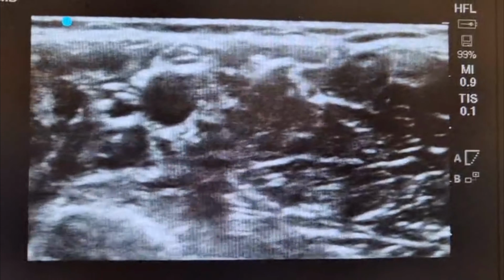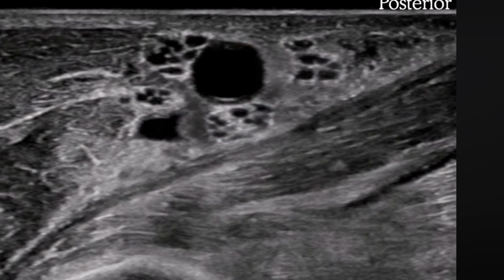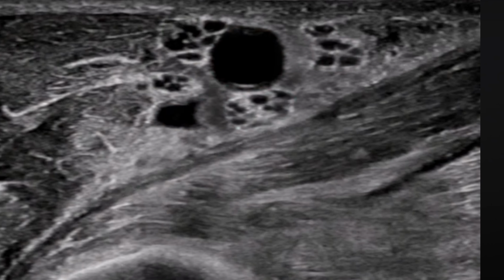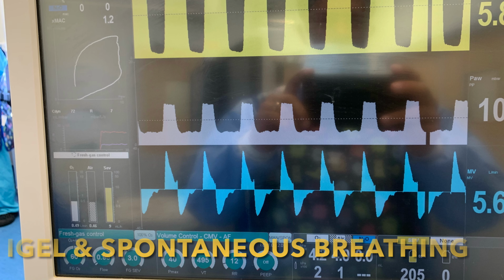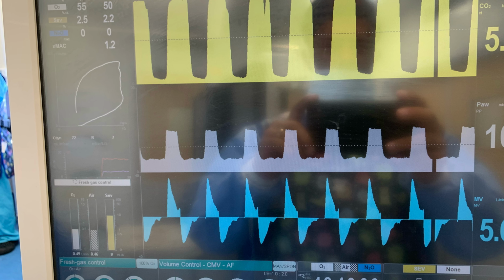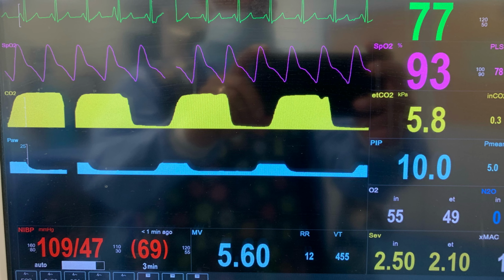These are the possible variations of anatomy in the general population. With the ultrasound probe, this is what you see in general. You just need to orient it. For pain relief, my patient had only 50 fentanyl on induction, and you can see the monitor how it shows. Look, it's quite stable and the block is very good and it will look after. I don't usually give anything else. Good luck with your block.